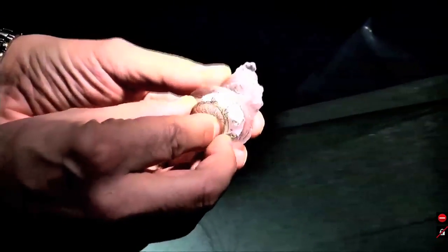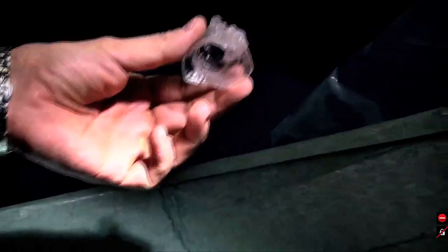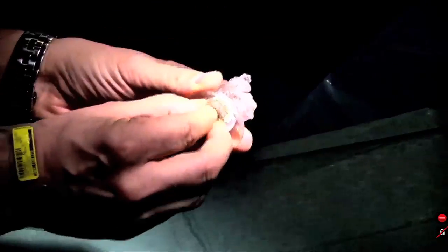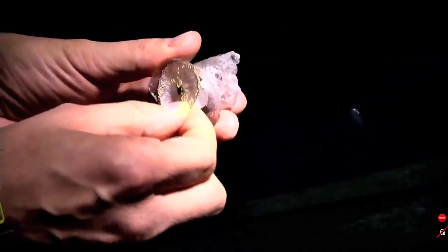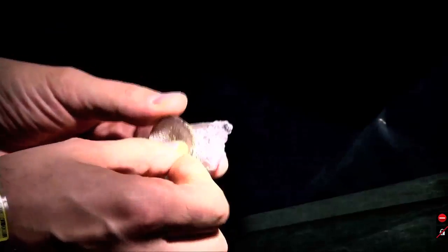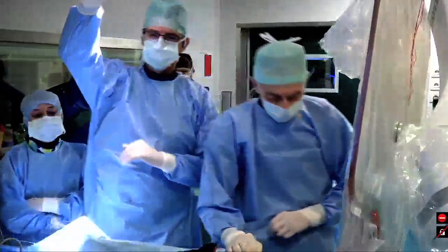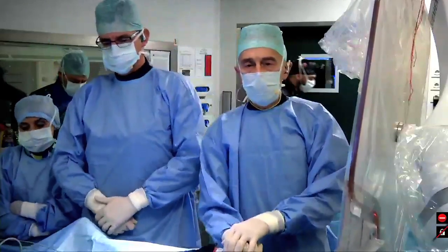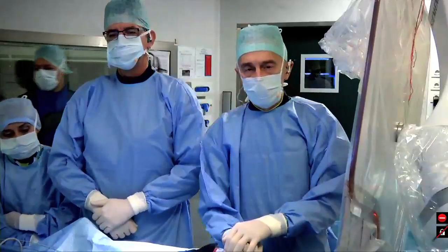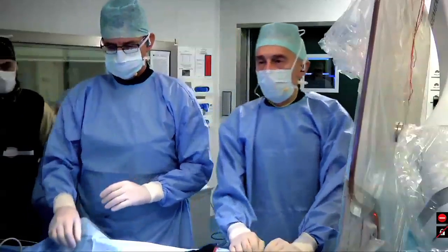Now we'll show you how to measure the device size. Claudio, what you're showing us is a 3D printout of this particular patient, correct? Is this something you routinely do on each patient to help you decide on the size and type of device? Or is this something particular about this case because you cannot do a TEE? Well, it's not daily practice. We usually decide based upon the pre-acquired CT scan, and if we have some doubts concerning the anatomy or the sizes, we'd like to have the 3D printing as well.